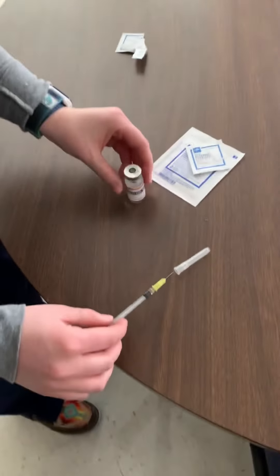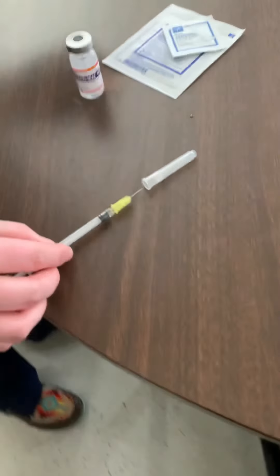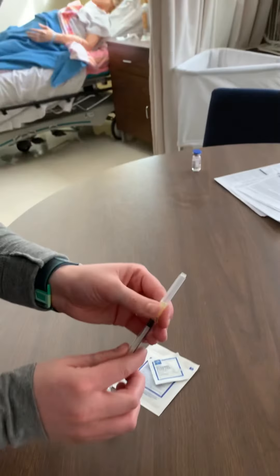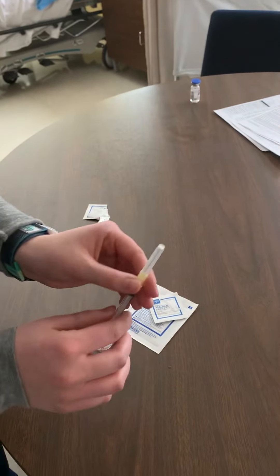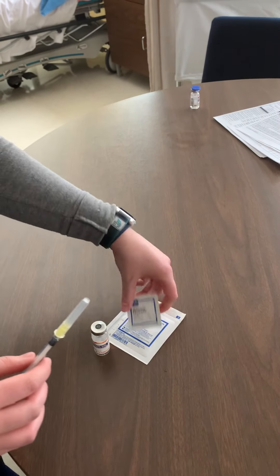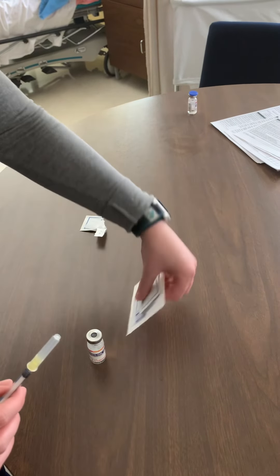I'll recap my needle using the one-hand technique. Now we'll go into the patient's room.